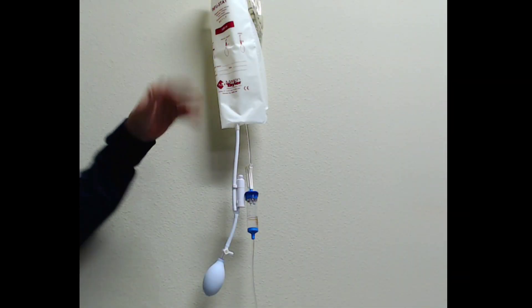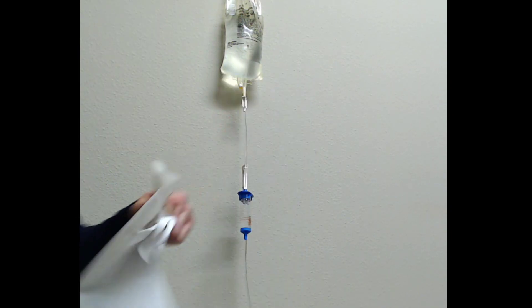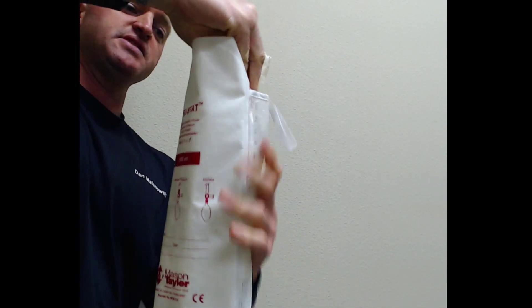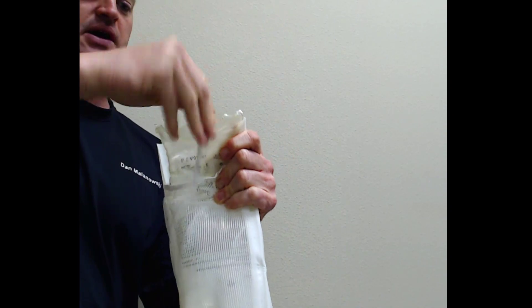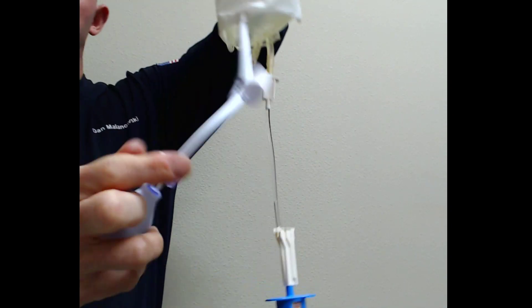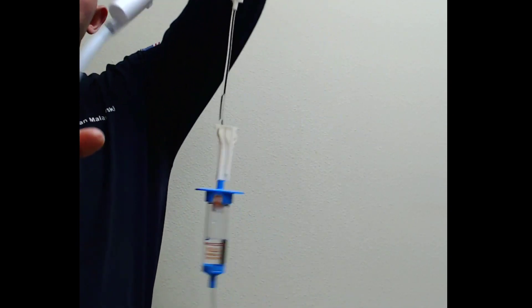We have our IV established already. We want to give a rapid fluid bolus, so we're going to put our pressure infuser on it. I like to stick my hand through the top of the sleeve, grab the IV bag, and put the sleeve right over the top. Come to this little string — some of them might have a hook — put that through your IV bag, and now this is going to hold your IV securely in place. Make sure the stopcock within your pressure bag is closed off, and we're going to start pumping up.